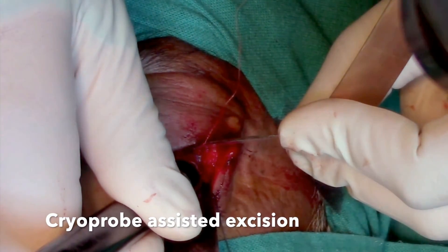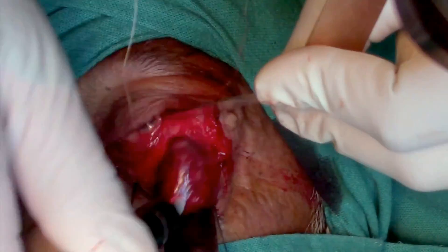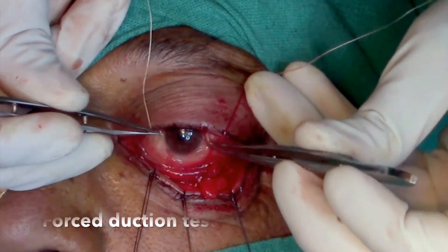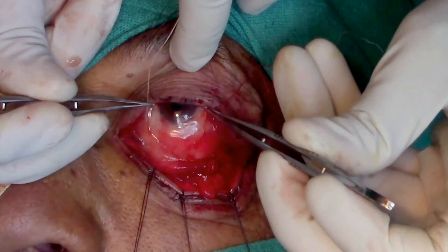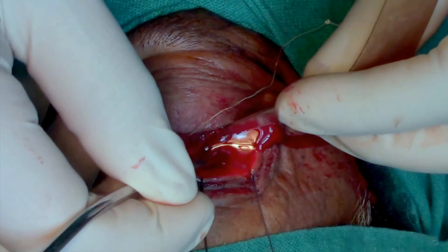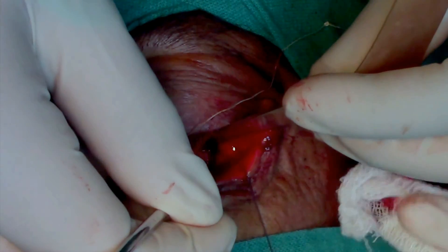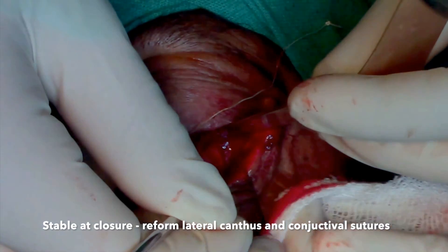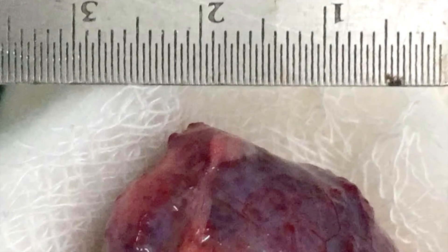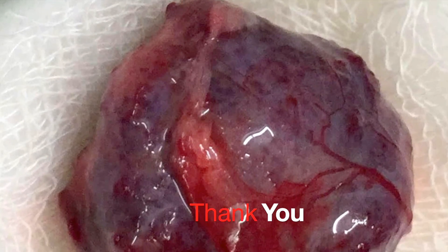Once the tumor is completely dissected, it can finally be delivered using a cryoprobe. Cavernous hemangiomas tend to pop out rather easily. A forced duction test may be performed to confirm there is no damage to the extraocular muscle. Check for hemorrhage and ensure there is no bleeding at the time of closure. The lateral canthus needs to be reformed and the lower lid retractors are sutured back. The conjunctiva needs to be sutured using interrupted absorbable sutures. This tumor was a cavernous hemangioma that was successfully removed via the transconjunctival incision.